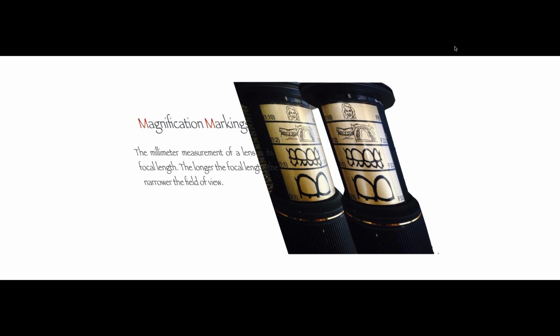Now, the magnification markings on the lens. This photo that you see on the right is actually the photo of my lens. And Dr. Haddock has a lens that is very similar to mine. It's just a different brand of lens, so they have different settings for his camera than I have in my camera. But we both have the benefit of having this sticker or marking on our lens that, as you can see, is actually made for dental photography.